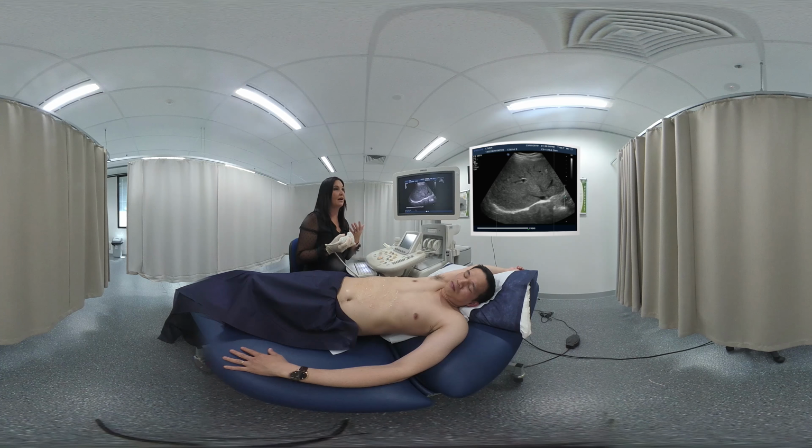The main adverse disease process that you've heard of is Hep B. So just be wary, take universal precautions when you're scanning the liver. Always glove up and always ask questions of your patient and write anything that you find out from your patient down on your worksheet.